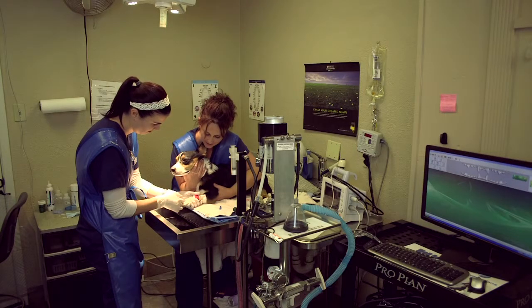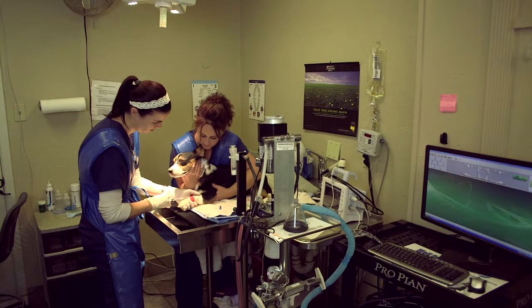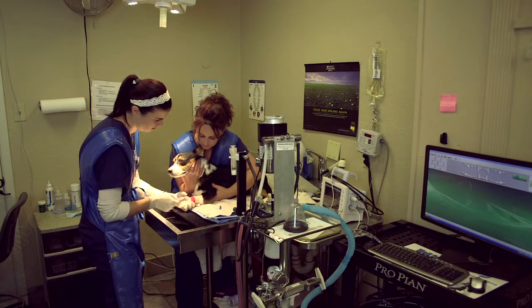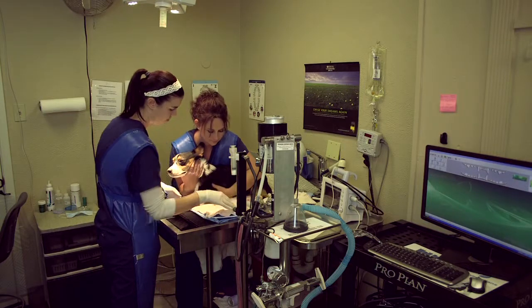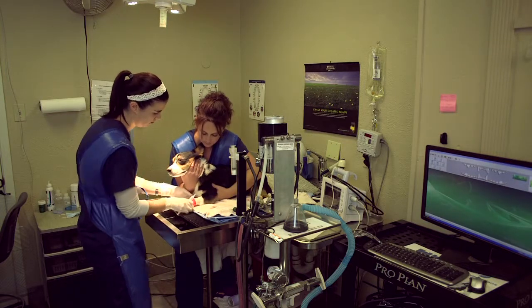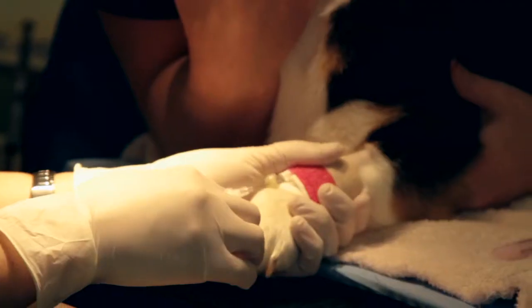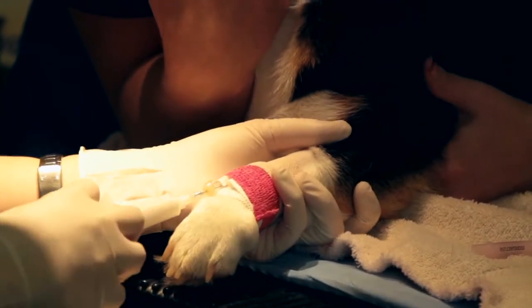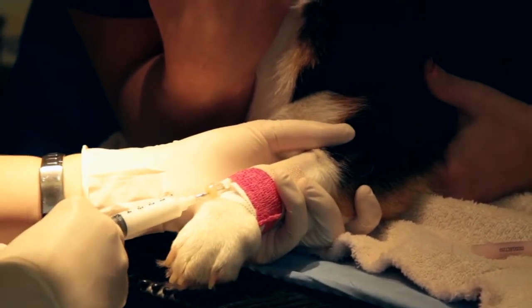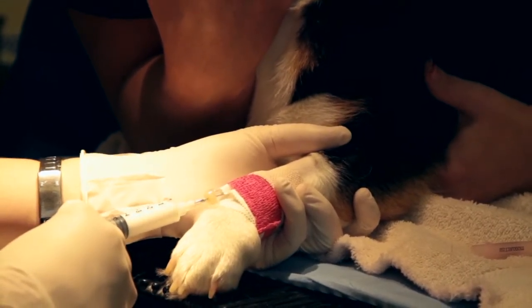Okay, now we have SNAP, and we have Chiquita Lyons and Dallas Edwards, and they are just about to induce general anesthesia in SNAP in preparation for dental x-rays, dental cleaning, and dental exam, an oral exam. You can see that the catheter is in place, and Miss Chiquita is injecting the anesthetic agent. Inject it very slowly. When we give this medication, we only give it as needed.